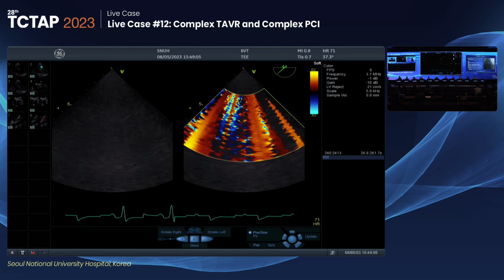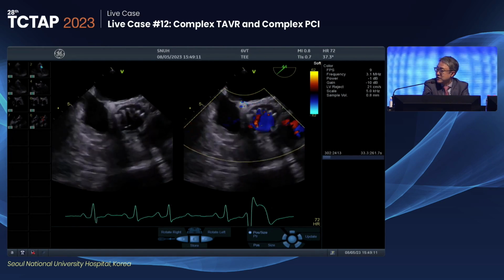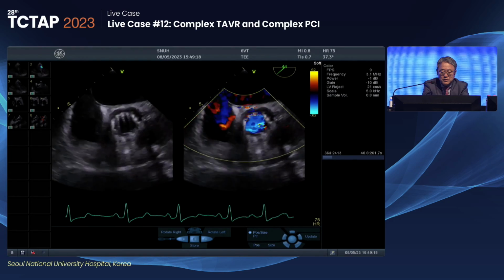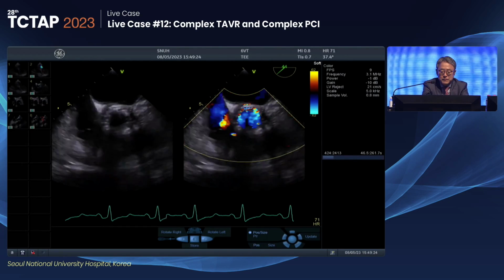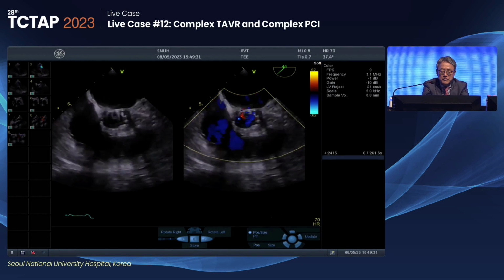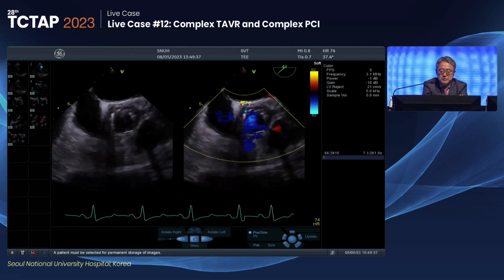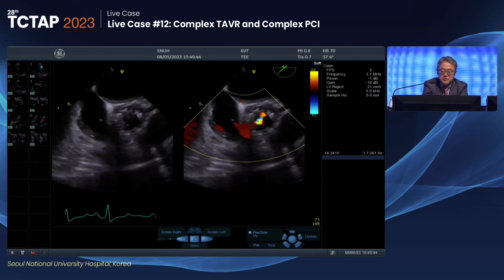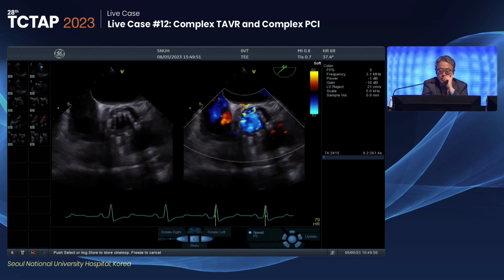Could you show us the amount of the PVR by the aortogram? There would be at least mild. As you can see, in the TEE image, most of the leakage is within the valve. Too much intravalvular regurgitation. You can see minor leakage at the 12 o'clock. I just manipulate the ventricular pigtail catheter to make some change of intravalvular regurgitation. Yeah, there's two jets. One is from the wire and one is paravalvular. So it would be helpful to change the pigtail in the LV.